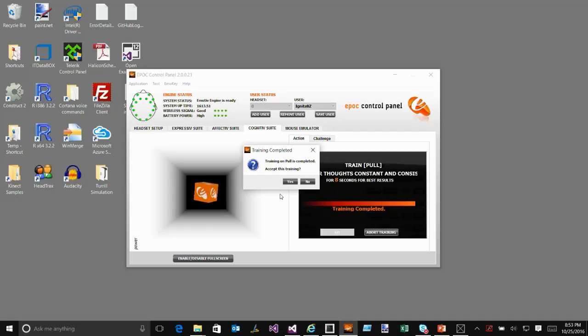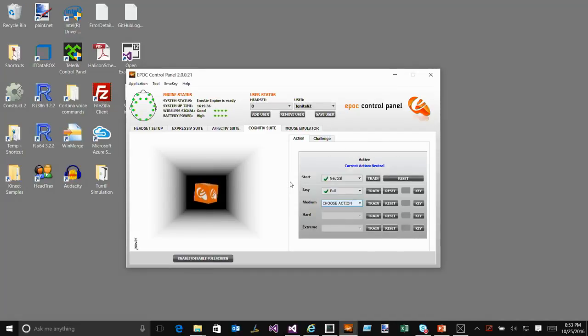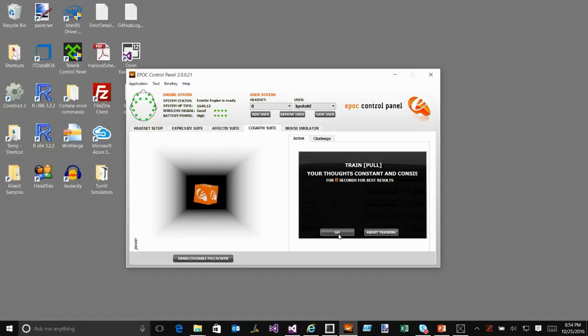Okay, so here we go. I'm going to hit yes, and now the cube is live. So I'm going to repeat that and try to think pull again and make the cube move towards me. All right, let me give it one more training because I was kind of distracted there.